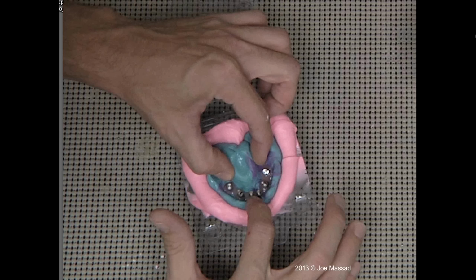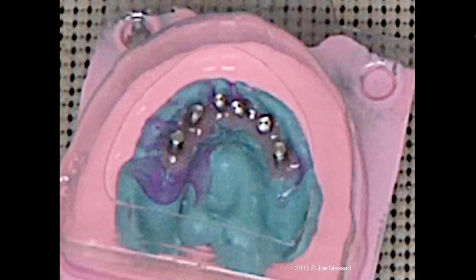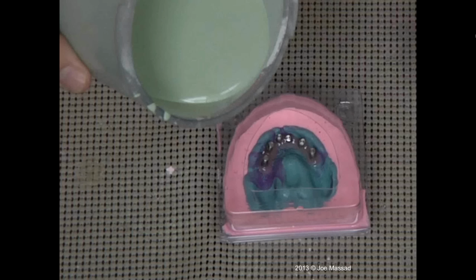And now I'm going to proportion the water powder ratio. In this case, I'm using Flowstone facet. Recommended powder to water is 100 to 24. I'm going to use 200 grams here. Therefore, we'll be using 200 to 48. And this will automatically be weighed, both water and powder, to the exact measurement.